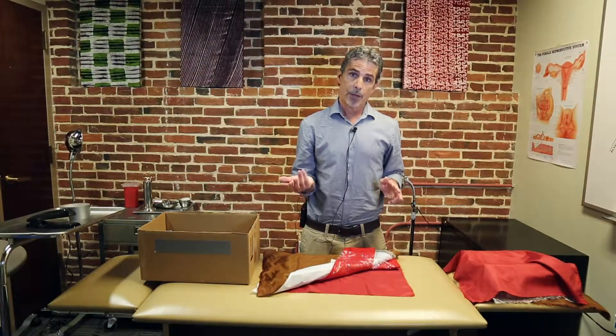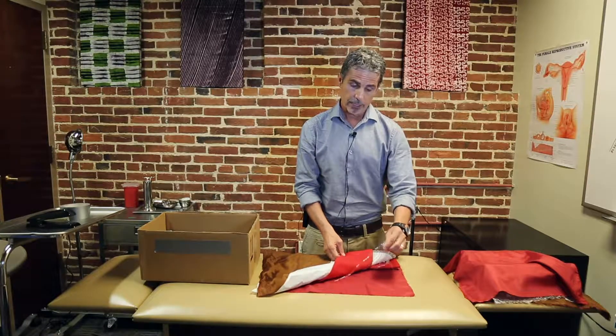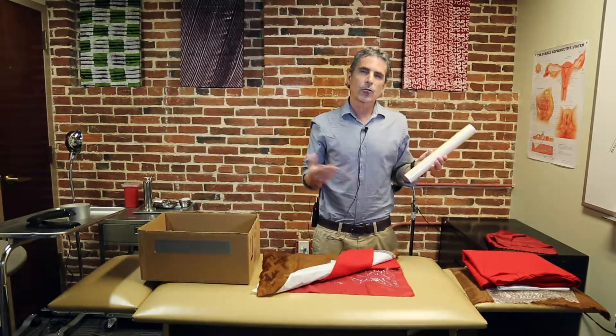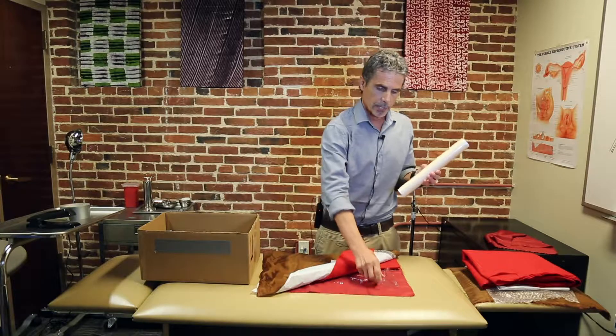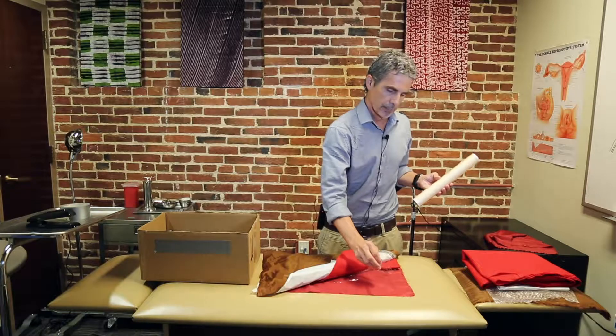The next layer is the peritoneum layer, and what we use for this is cling wrap. You can use cling wrap or other materials, but cling wrap tends to work quite well because it's transparent and looks very similar to peritoneum.